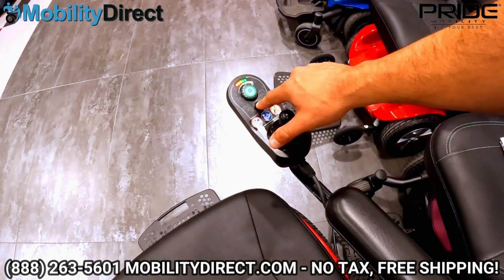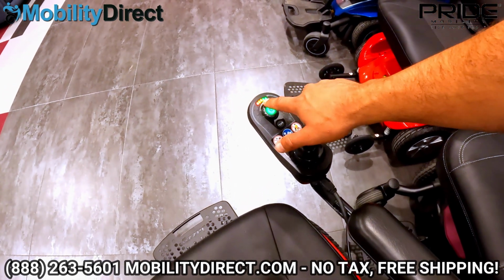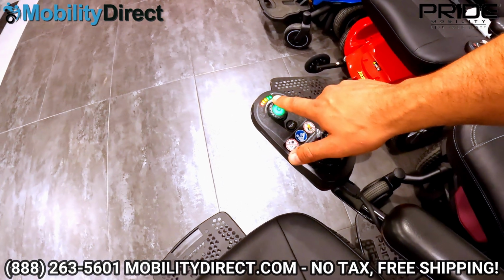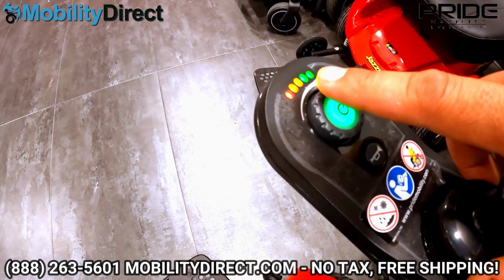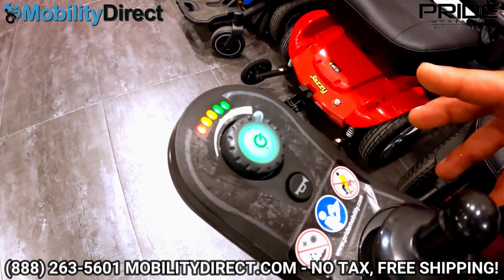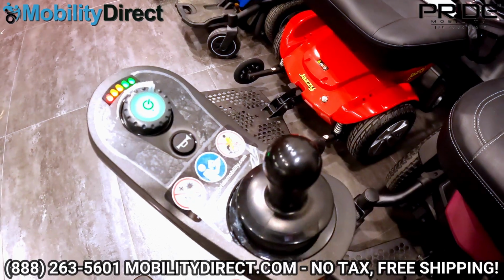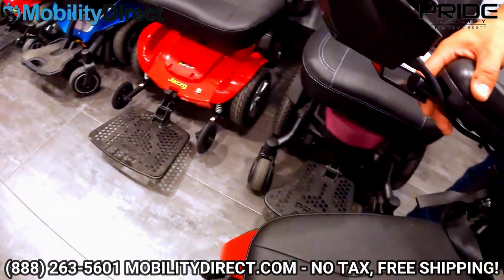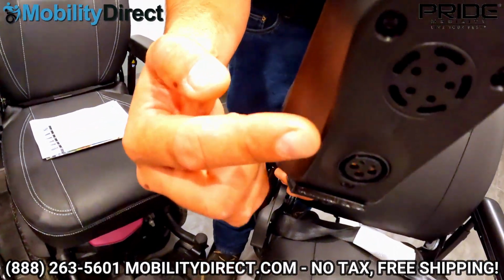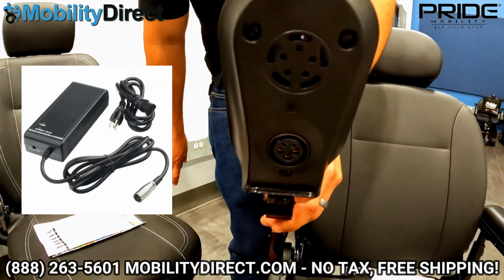It has a horn button in the middle, and these lights are going to give you the status of the battery charge. Right now it's fully charged, but as you start to use it, each light starting from the green all the way to the right will start to disappear, turn off, and that's going to show you when your battery's running out. Now the charging port for the batteries, it's actually right here up high underneath the joystick. It uses a 3-pin barrel connector known as an XLR charger.